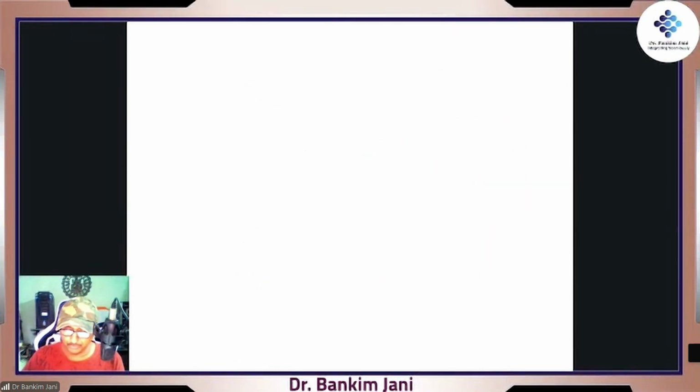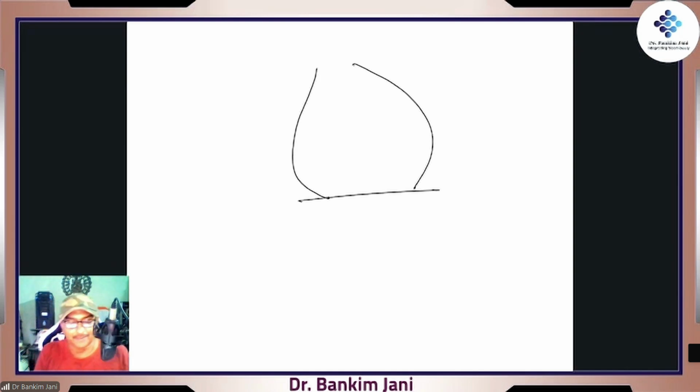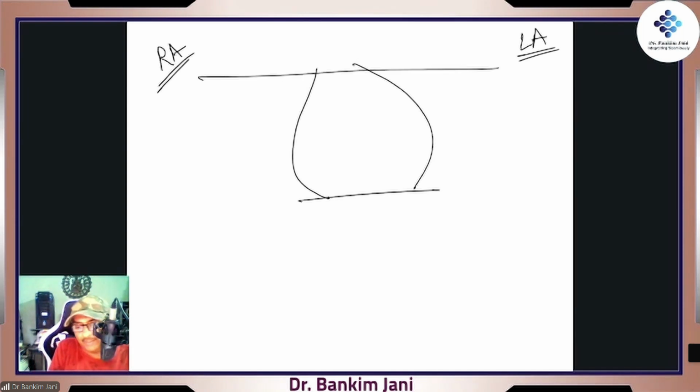Now we come back to one concept. That's the heart. Right arm, left arm, lead 1 we have drawn.